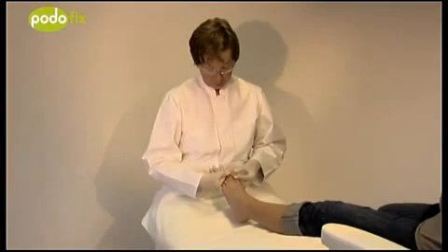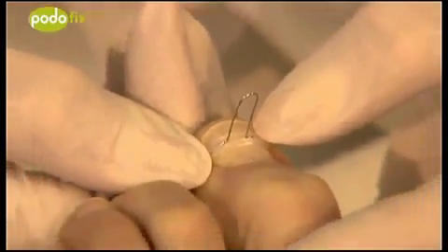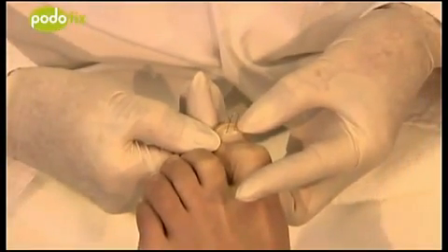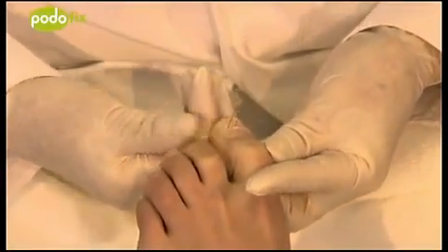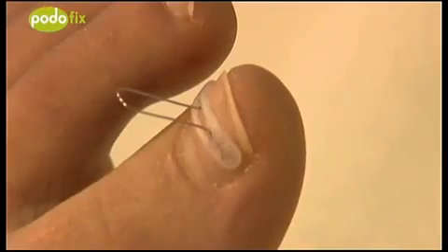Before activation, wait 2 minutes until the adhesive has hardened. If adhering does not work the first time, the nail must be completely freed from adhesive and must then be completely cleaned. Use a new brace and ensure that a small amount of adhesive is used.